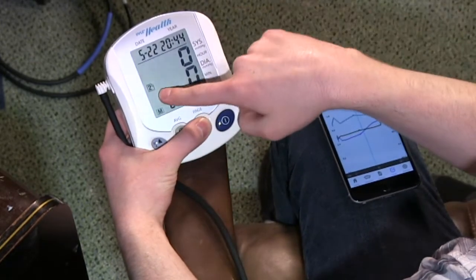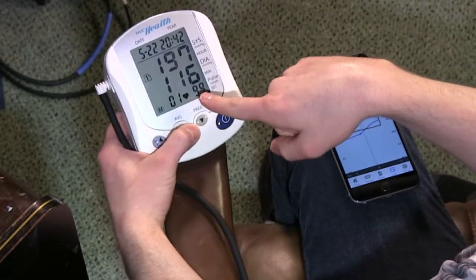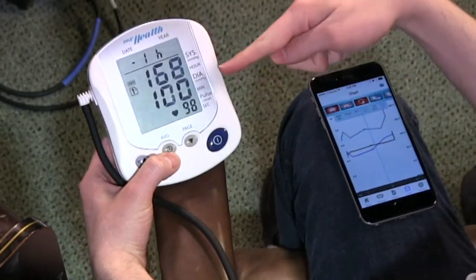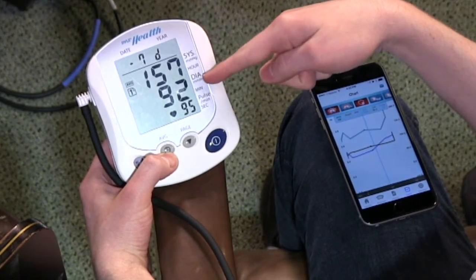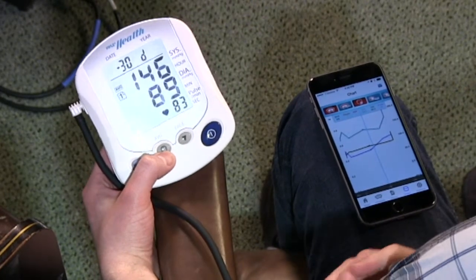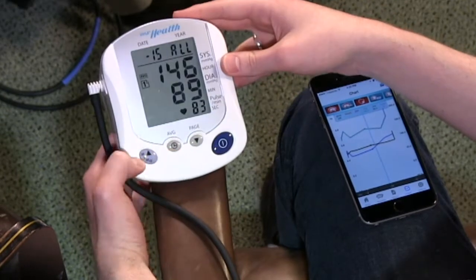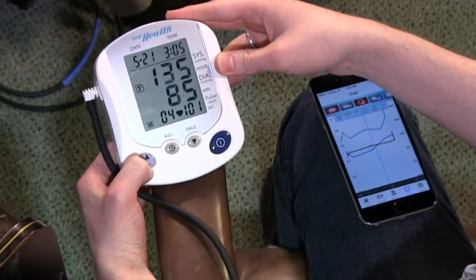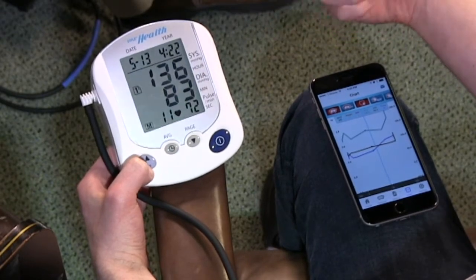Here, you can choose between the different people. So I'm number 1. You can also choose between averages. So if I want to see my hour average, my day average, my 7-day average, you can see this is a little bit better than what I just took. I have some lisinopril in the other room. Or maybe some nitroglycerin at this point would be good. And then it does all as well. So this is my average forever. This is nice that it does it all just on the device. You can also go back between the specific readings each time if you want to.